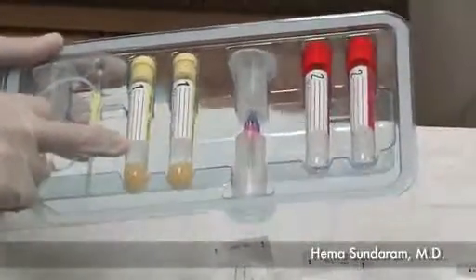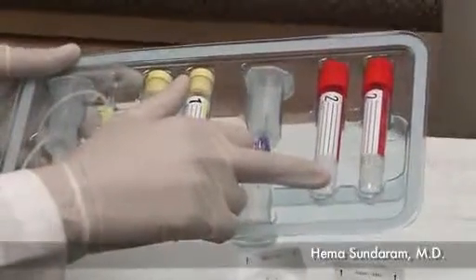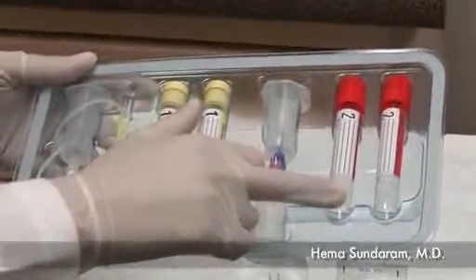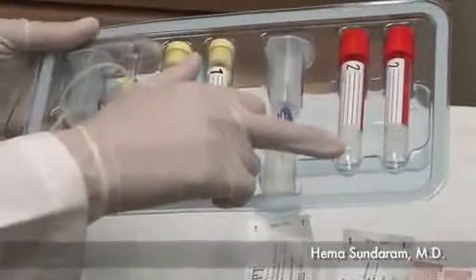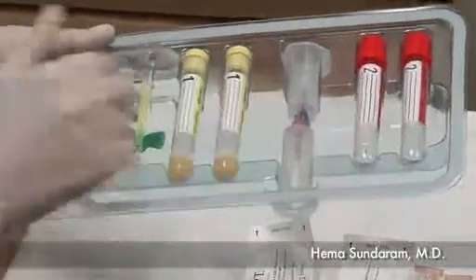What remains will then be transferred using a transfer device into this red top tube, which contains calcium chloride. This will cause the conversion of fibrinogen to fibrin, and we will then have in this tube the full platelet-rich fibrin matrix, which will be ready for injection.